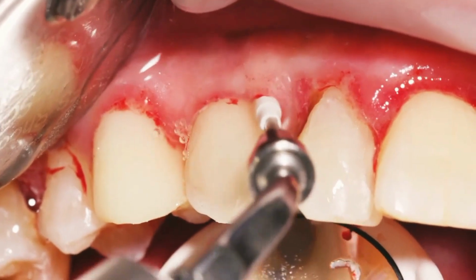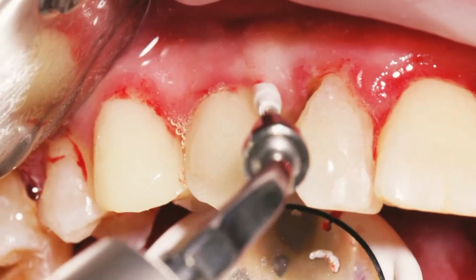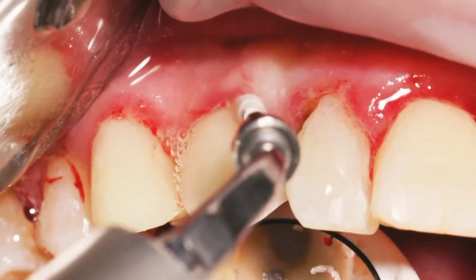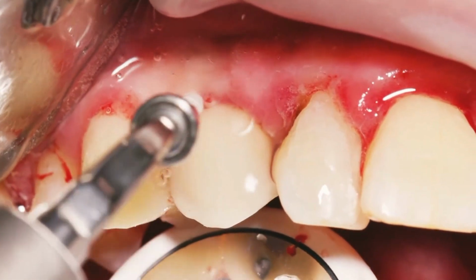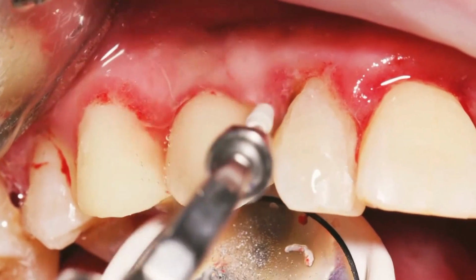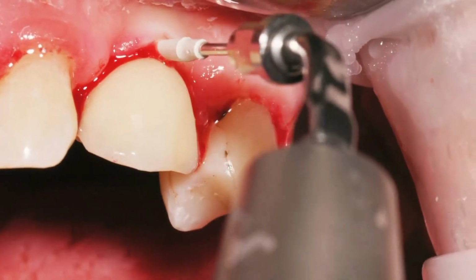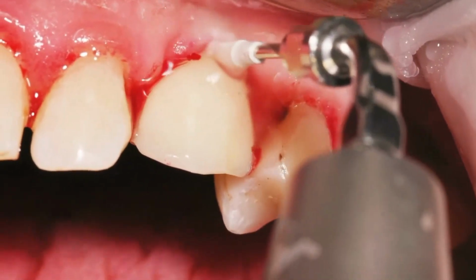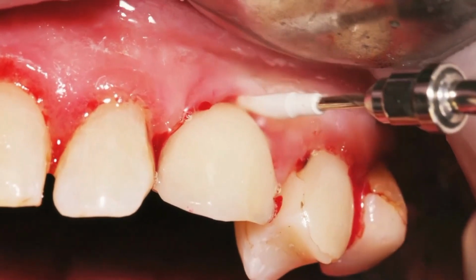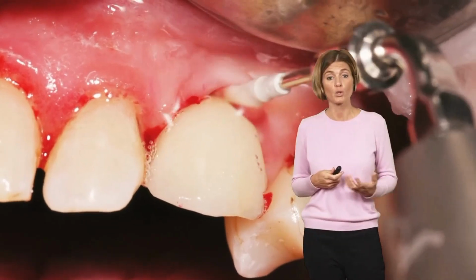So a combination between periflow nozzles and PI tip to have the cavitation and the subgingival vibration, to remove eventually residual cement if we have a cemented crown, or calculus if there is any calculus in the first 4 or 5 millimeters of the transmucosal tunnel.